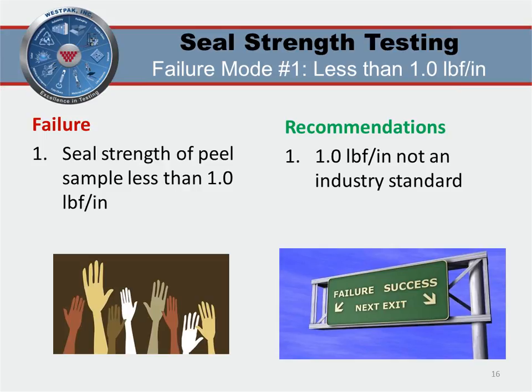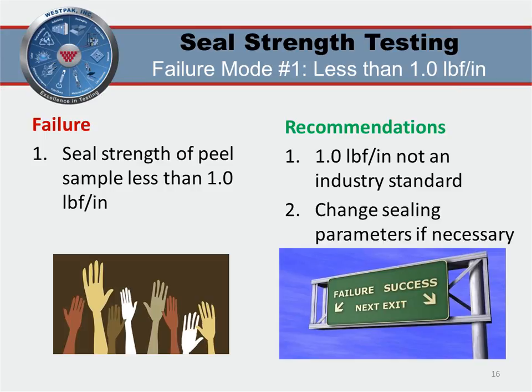We generally see protocols with passing criteria starting from about 0.75 to 1 pound force per inch. But if lower seal strength does interfere with your package integrity, this can normally be fixed by adjusting your sealing parameters to provide a stronger seal.